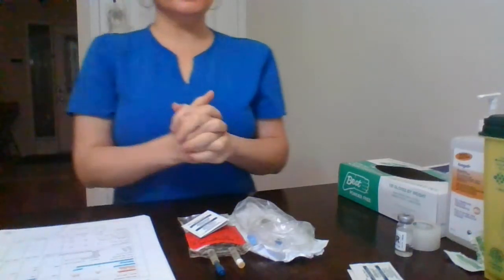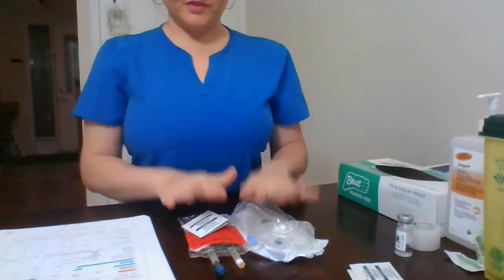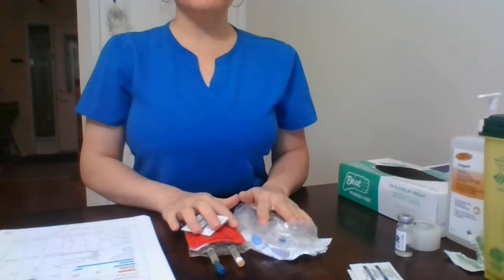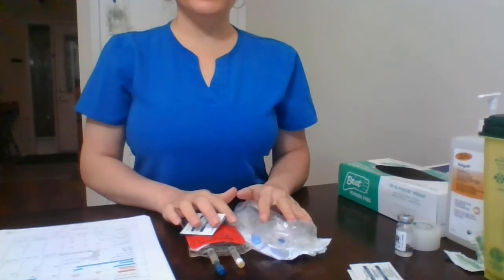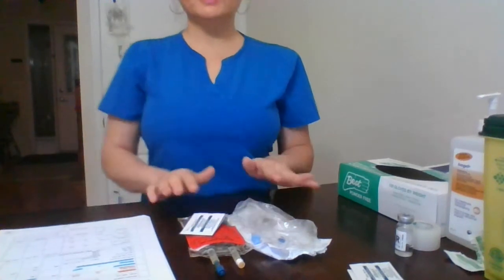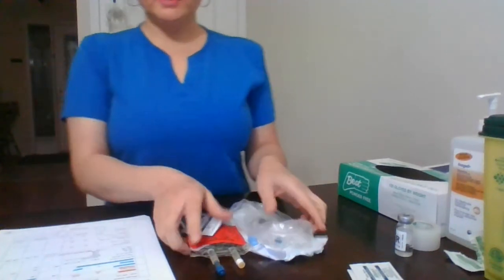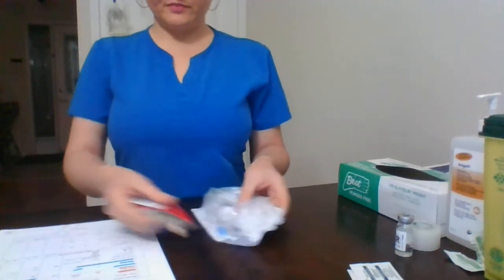So during this time, before I start the infusion, I will make sure that my medication is compatible with the primary infusion, and also I will assess my patient's IV site to see if there is any redness or any infiltration. So now we're ready to go to our patient's room.